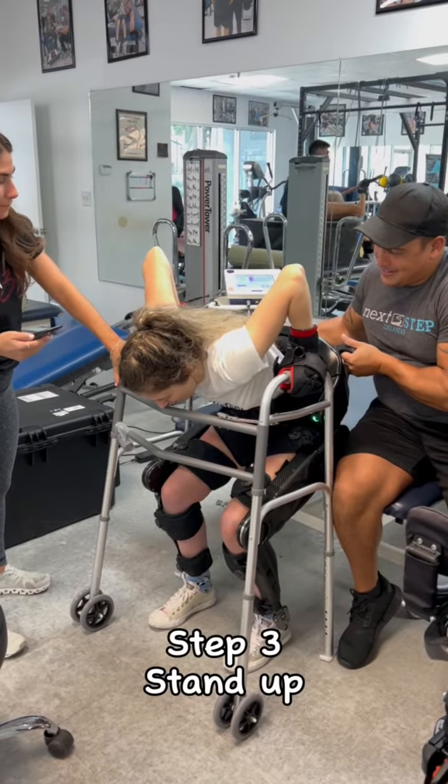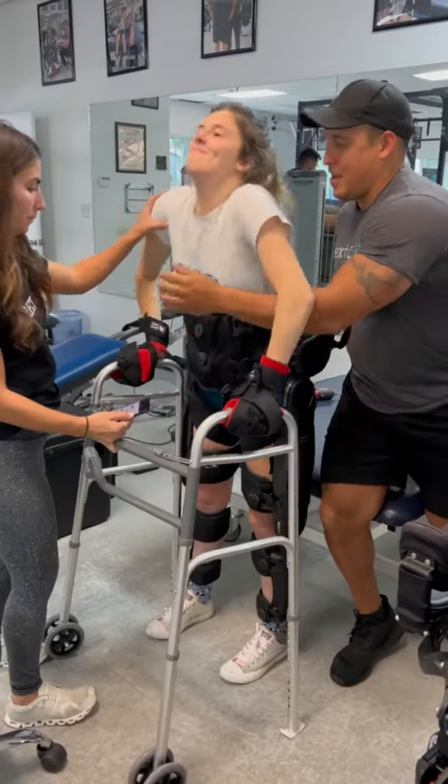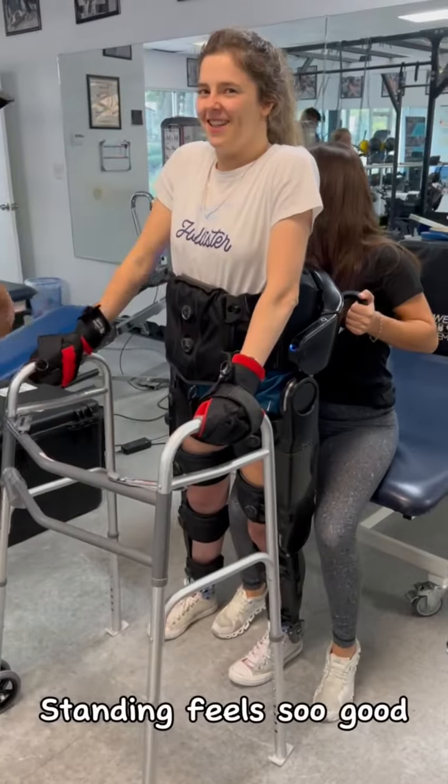Step 3: stand up. Standing feels so good.